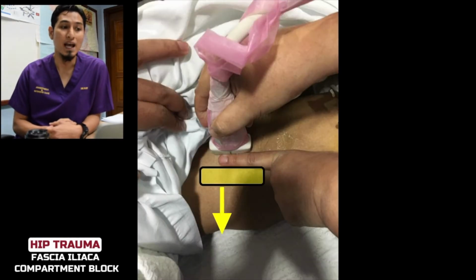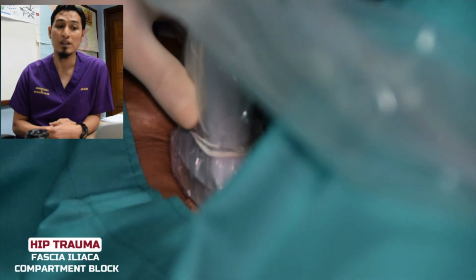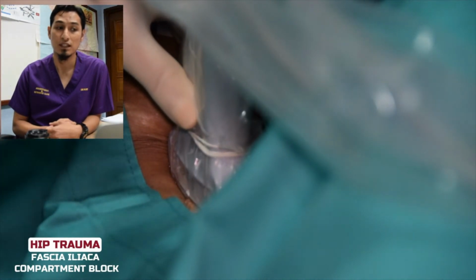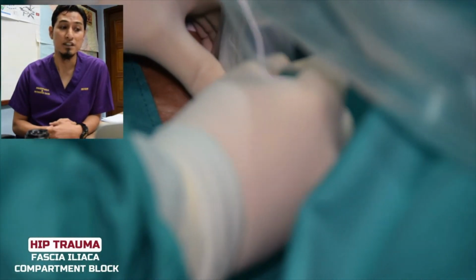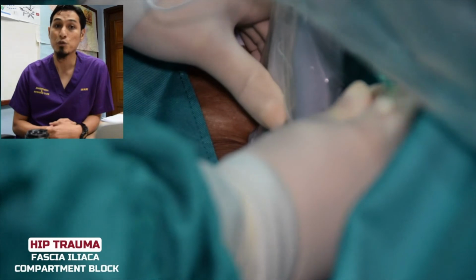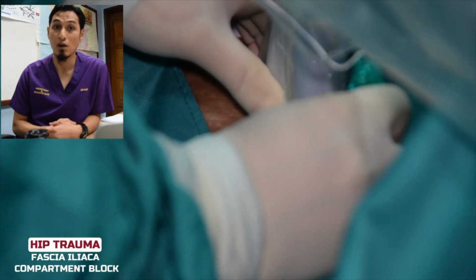Patient in supine position. First, we identify anterior superior iliac spine laterally. Place an index finger immediately medial to the spine. Align a high frequency linear transducer immediately next to this finger with the caudal end of transducer just above the inguinal ligament. Alignment of this transducer should be superior medial to inferior lateral from cranial to caudal.